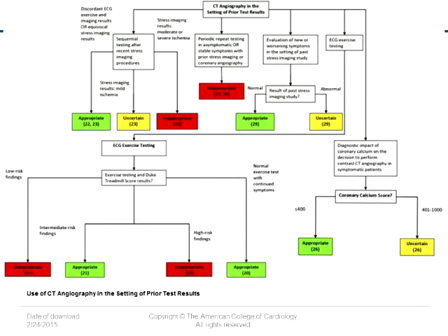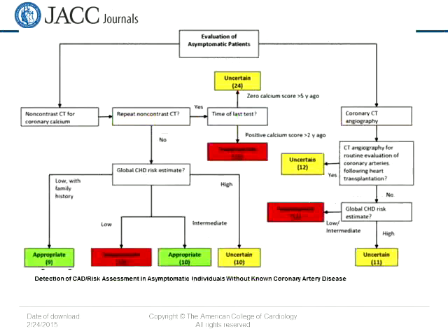If the patients have signs of ischemia on their initial stress test, it's unclear whether or not you should do an additional imaging modality. You should really just go straight to cath, in my opinion. And if they have significant ischemia, it's clearly inappropriate. That's what I wanted you to get out of that slide.